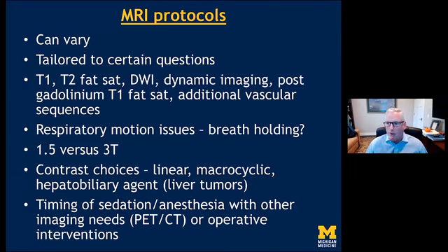However, there are some advantages to using 3T. Contrast choices. There's debates about safety with regards to the potential for NSF and using either linear or macrocyclic agents. Sometimes for the liver tumors, we even use hepatobiliary agents, such as gadoxetate.